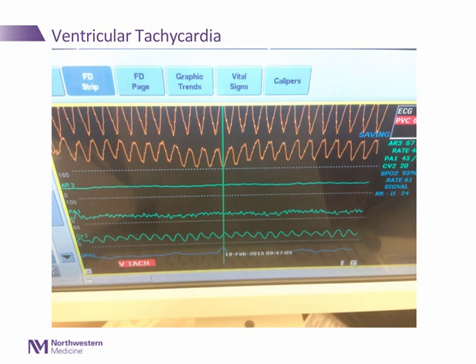This concludes this educational session on the use of inpatient telemetry. The viewer should now have the skills to methodically assess telemetry for the presence of arrhythmias, determine the likely etiology of common clinical arrhythmias, and distinguish a true arrhythmia from telemetry artifact.